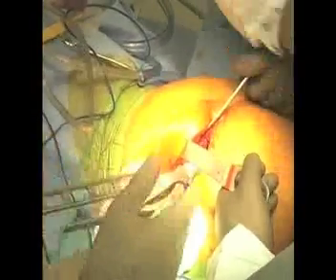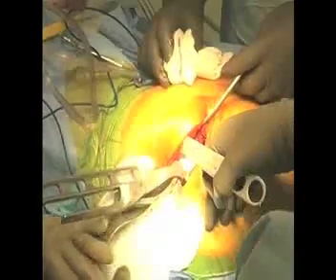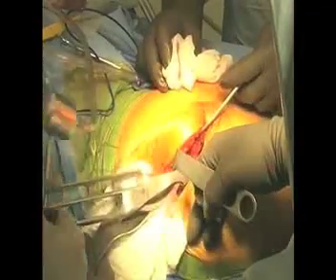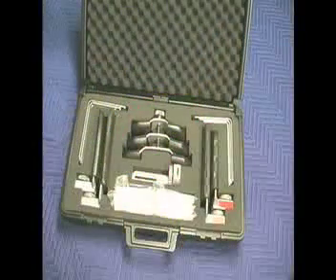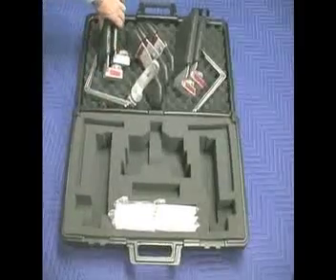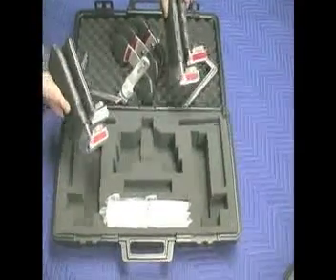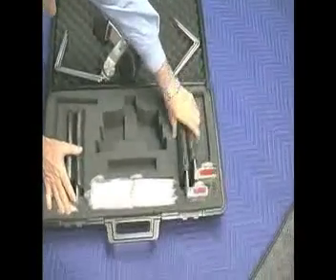The Hip Grip system by Sun Medica achieves all of these goals. The Hip Grip system is a patented product that supports not only the pelvis — it holds the chest by utilizing anterior and posterior chest supports. This keeps the spine from twisting the pelvis and also allows tilting of the operating table without loss of position of the pelvis relative to the operating table.